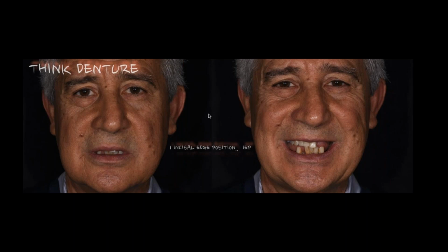This is where the photography is actually going to help me. I'm looking at the patient's face, I'm treating it like a denture, and my question to myself is, where does the incisal edge belong? Step one. Where do I put the teeth in his face? Now, I don't know at this moment if this is going to be a denture, a fixed detachable, maybe an implant-driven hybrid, or maybe it's going to be crown and bridge. I don't really know that at this moment. And I have to be honest with you, that's not my first concern. My first concern is, where do the teeth belong in his face?